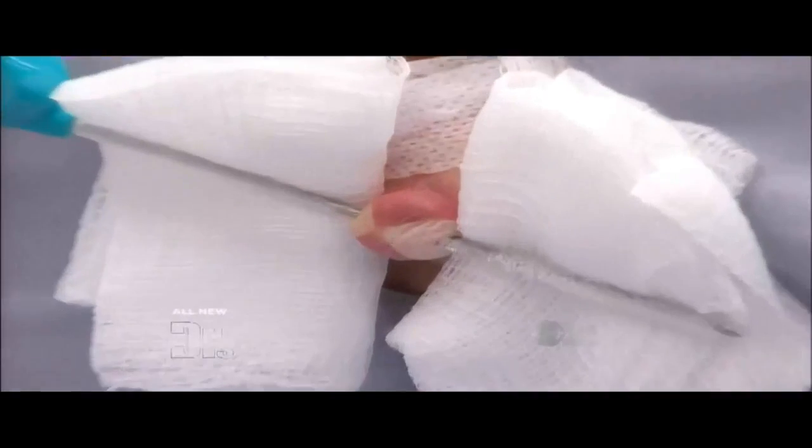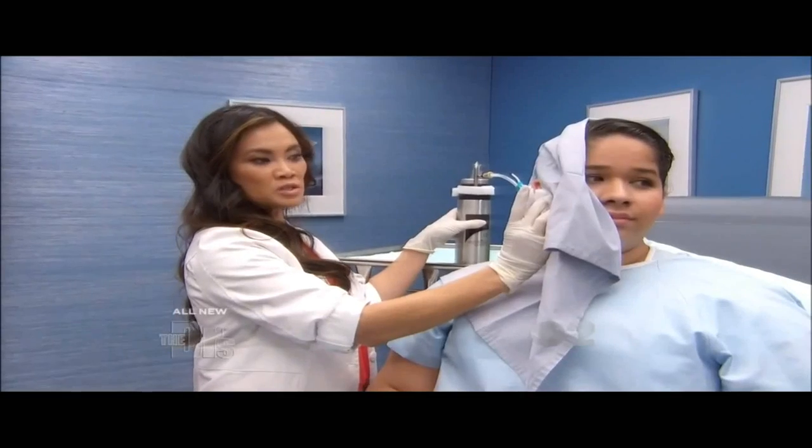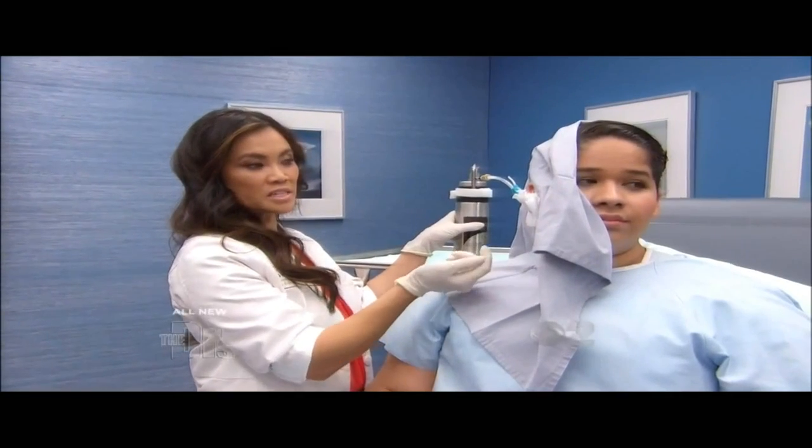Scary to think, well, this could happen just from getting your ears pierced. Well, and that's so typical for younger women who get their ears pierced. In this case, they've just made a probe, and when we insert the probe in the center of the keloid, as you can see here, it freezes it from the inside out.